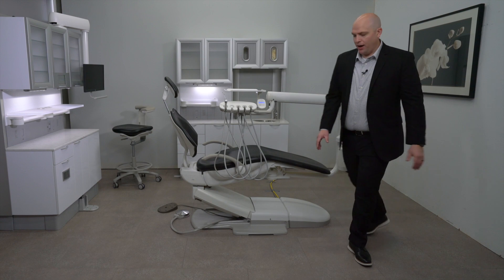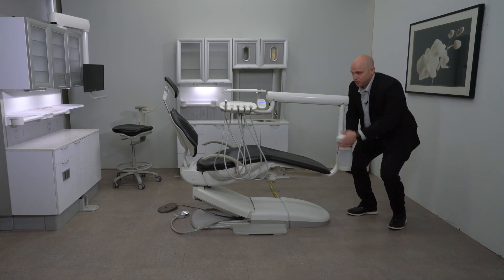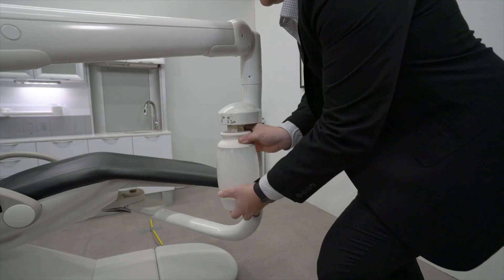The water bottle can be found at the toe of the chair on the post. Make sure the power is off to the chair before removing the water bottle.